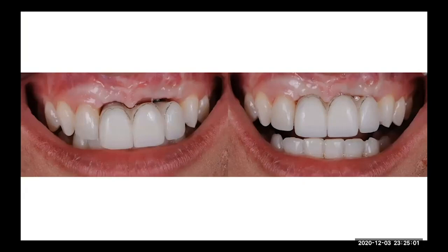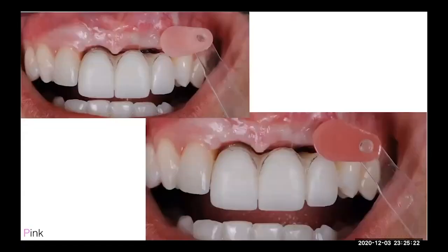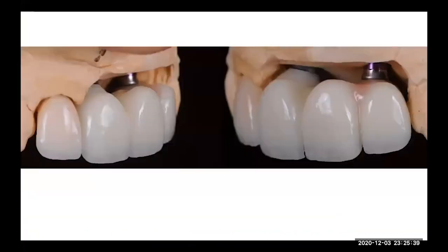This is our case at the moment that the patient came. We start doing the try-in, shaping the teeth, organizing occlusion, pushing a little bit of soft tissue. If we have too much pressure, we start removing pressure little by little. Now we know that we don't have papilla in that space, so we took the color of the gum. Then we go to the lab, and you can see now the translucency as we start creating the incisal edges little by little. Then we go to the lab and we finish our case.